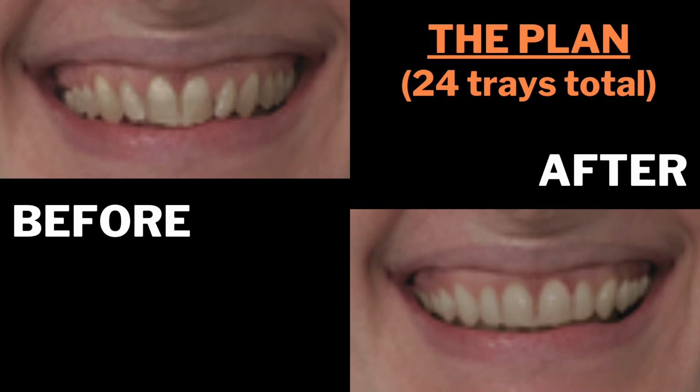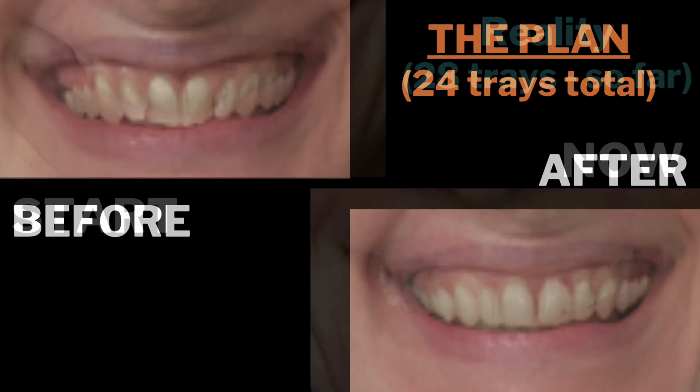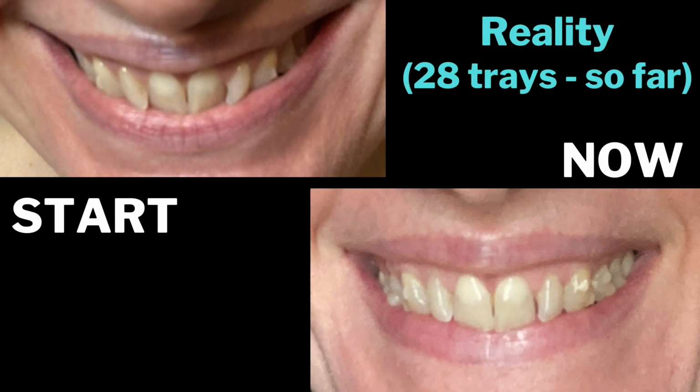From the picture, you can see what my original plan was and the simulation of how my teeth were going to look. Initially, it was 24 trays for both the upper and the lower teeth. About halfway through that initial plan, my upper teeth went off track, so we had to run a different set of trays for them. Now from this picture, you can see the current reality of what's going on with my upper teeth. It doesn't look like a dramatic change at this point because they work from the back teeth all the way to the front teeth. So now the front teeth are going to be showing that really dramatic change.